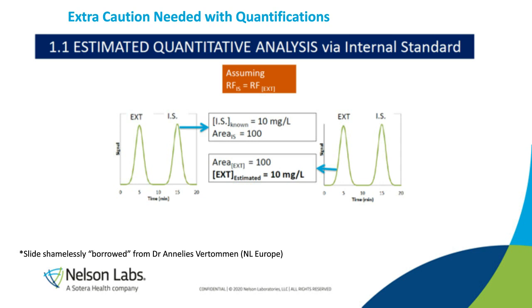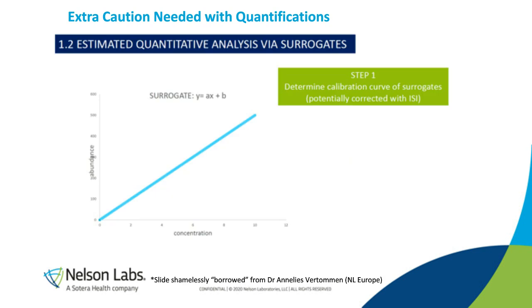And so it's true that you do have to estimate the concentration of these screen compounds somehow. I think that just using your internal standard is something you might have to use sometimes, but there are definitely better ways to do that. And what the FDA is pointing out in their last feedback is they say, okay, rather than just use an internal standard, what you should have is, in addition to the internal standard, some surrogates, so at least 5 by LCMS and at least 3 by GCMS. And these are compounds with differing properties that you've made detailed calibration curves for.